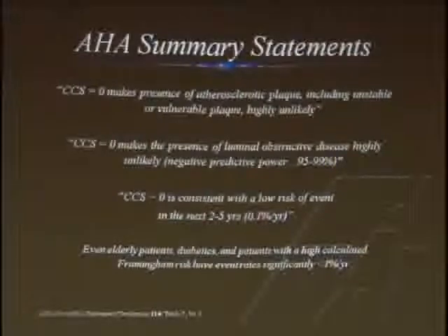About 60% of the patients who come to us end up having a calcium score of 0. So it can be very useful to reassure those patients, even ones with really weird, atypical chest pain that doesn't sound cardiac, but calcium score is 0. That information alone is more accurate than any other diagnostic tests that we have right now, any stress testing.